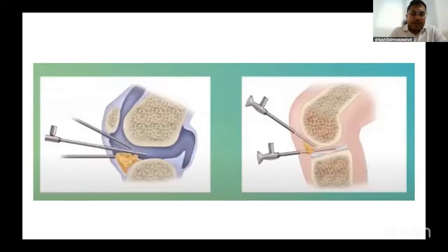So ideal would be something in between, but at the same time, people may have variations with the fat pad, and what I have learned from seniors is that most of them just try to remove as much of what comes in the way and try to retain as much as possible.